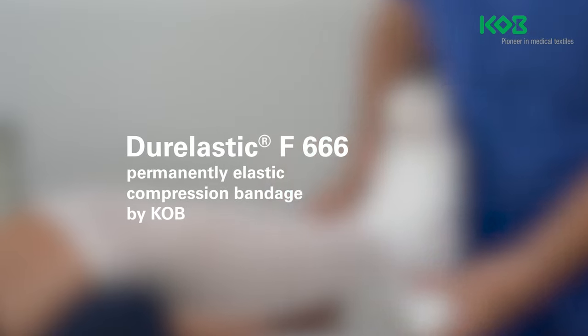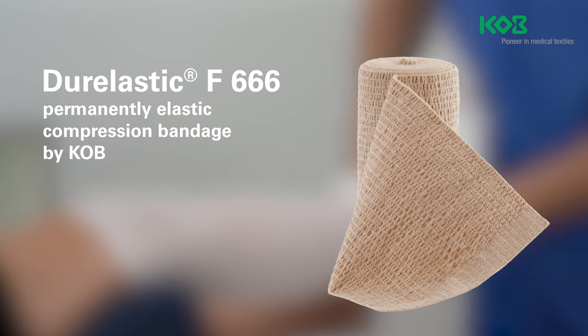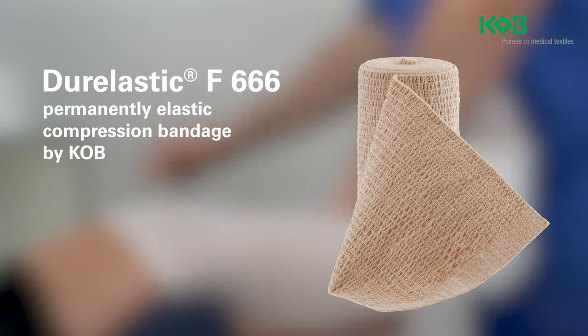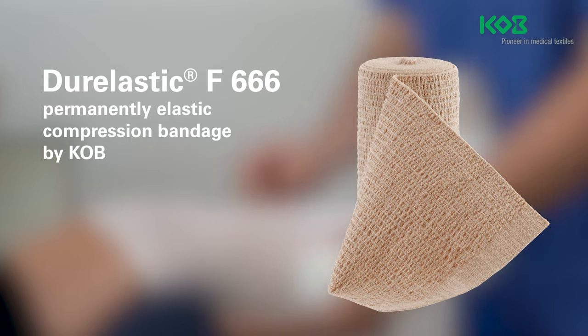The Dura Elastic F666 by KOB is a reusable permanently elastic long stretch compression bandage. Long stretch bandages are used in compression therapy for venous diseases and for the treatment of oedema caused by other factors such as post-operative and post-traumatic oedema and cyclical idiopathic oedema.